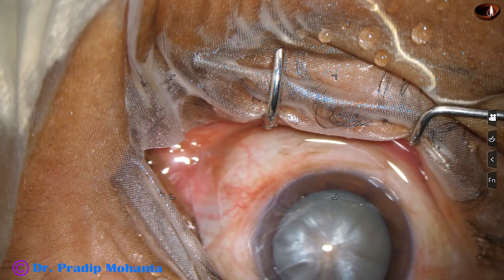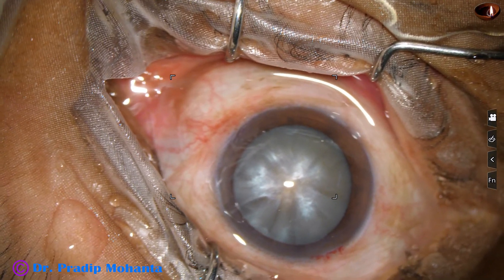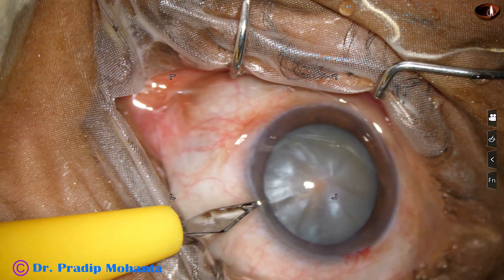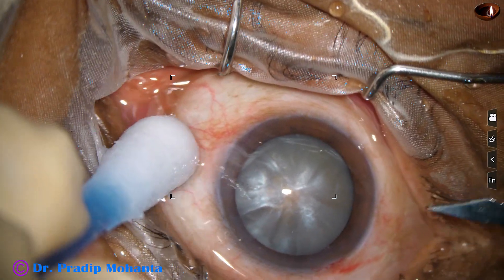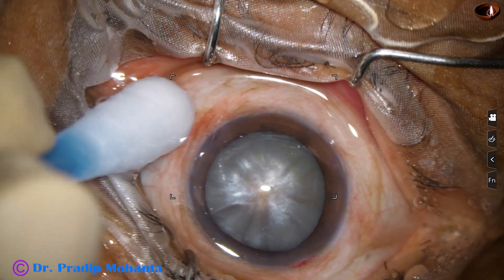Now a side port is to be made. The side port is made on the left side of the main incision about 3 clock hours away. One more side port is made at around 8 o'clock.